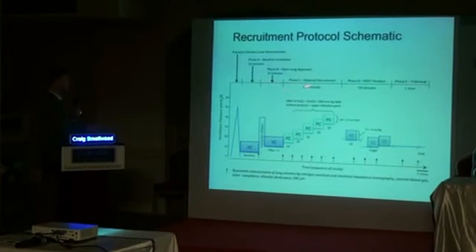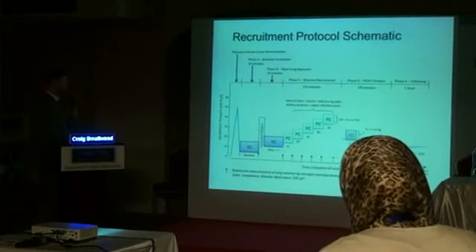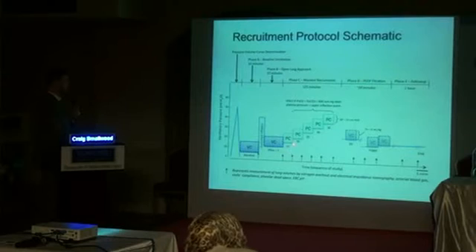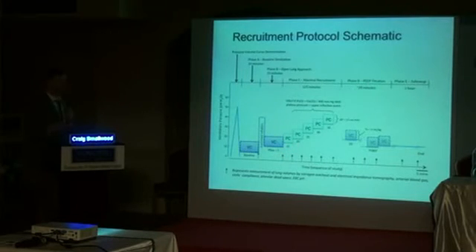And then the phase C, or the maximal recruitment phase of the ventilator protocol, is this. And this is the brave part. So we fixed our delta pressure to 15 centimeters of water, and then we put them on a PEEP of 15, so 30 over 15. And you can see why we didn't want to start this in newborns. We didn't want to blow them up.